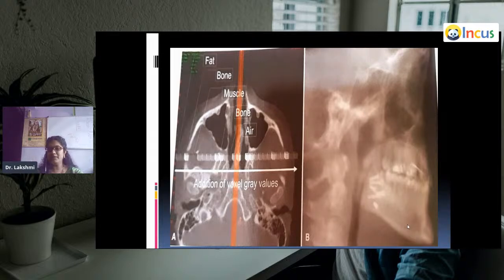You can look at the image and find out. It is not clear. It has a blur. That means anatomic noise is there, and there are objects which are superimposing over each other. So diagnostically, maybe certain structures might be confusing as well. Okay, so that is the disadvantage of a Raysum format of the CBCT image formatting.